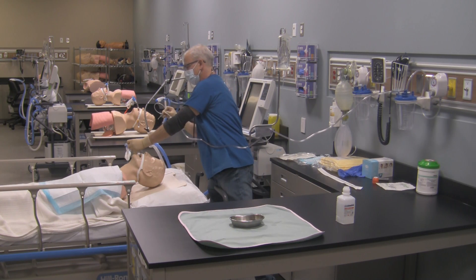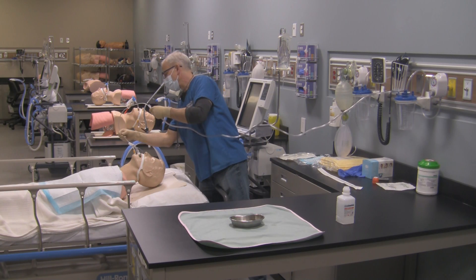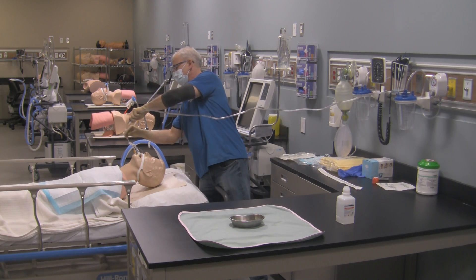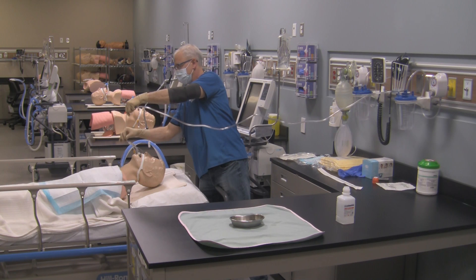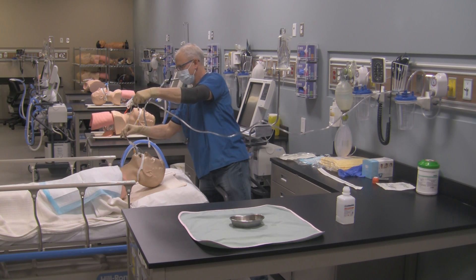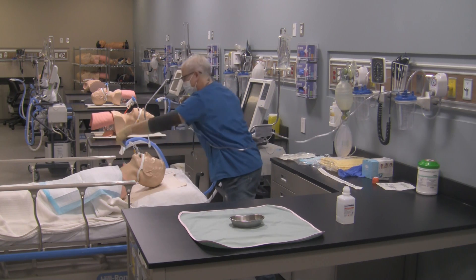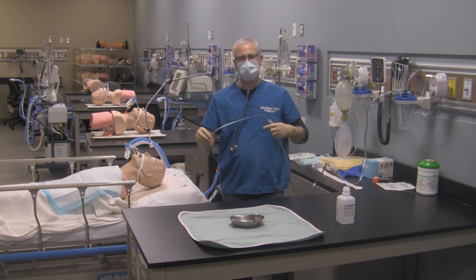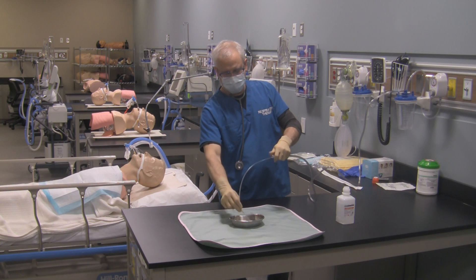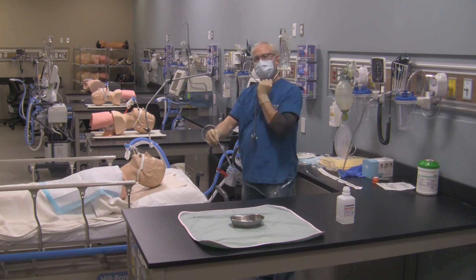Take the tubing connection off the endotracheal tube. Line the catheter up at the center of the endotracheal tube and advance the catheter into the patient's airway. Feel that resistance, pull back a centimeter, apply suction, and rotate the catheter slightly as you withdraw it from the endotracheal tube. Loop the tubing, reach over, grab the ventilator connection, and the patient receives mechanical ventilation. Clean out your suction catheter, then go and listen to the patient's chest again.